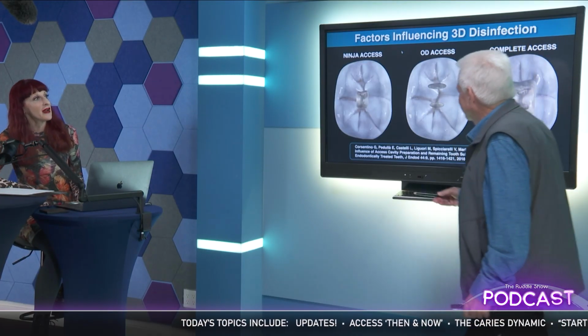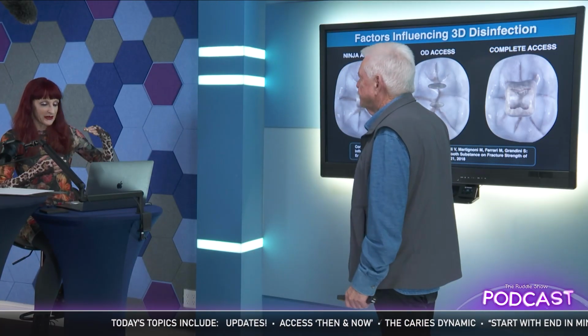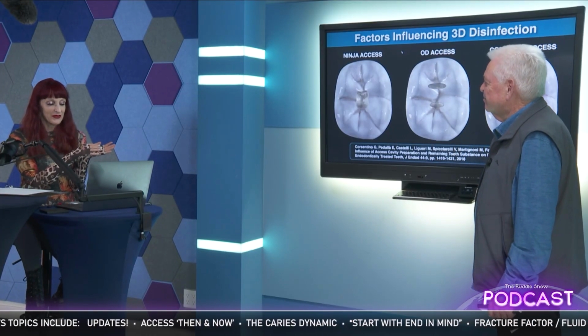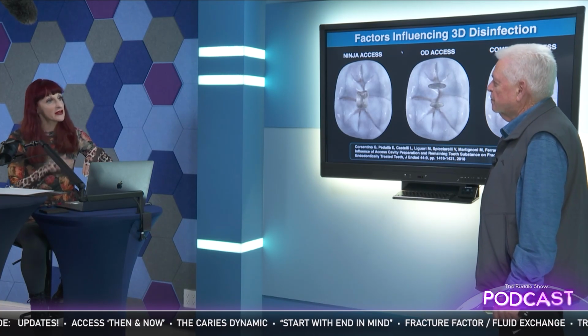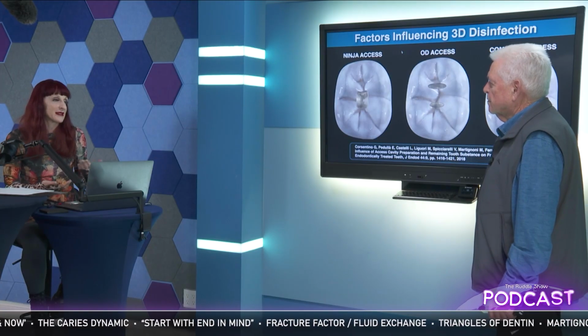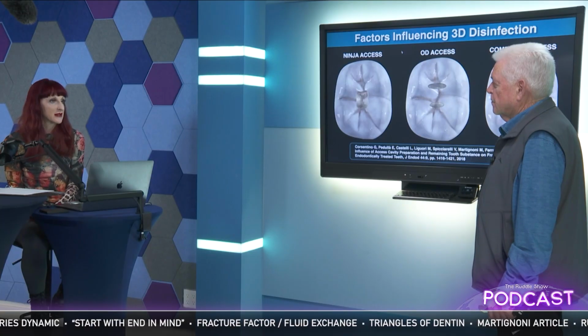But now I asked you about it the other day, and I noticed that when you were saying this, like when you put your file in and the handle's way off axis versus access, way off axis, then I'm getting now that it's curving to go into the canal. And then if you have a curvature later in the canal, it will have to curve again. So then you are having to deal with a double curve versus just going straight down and then dealing with the one curve. And you said, yes, it's safer, it's more efficient if you don't have to deal with the double curvature.